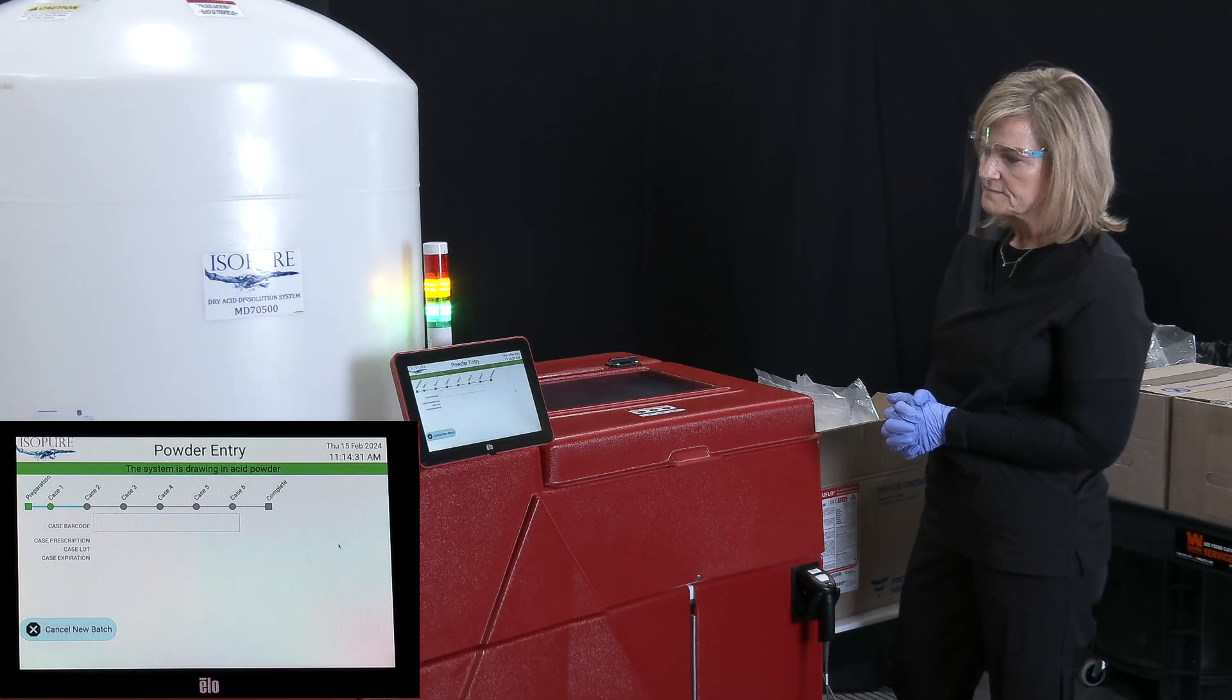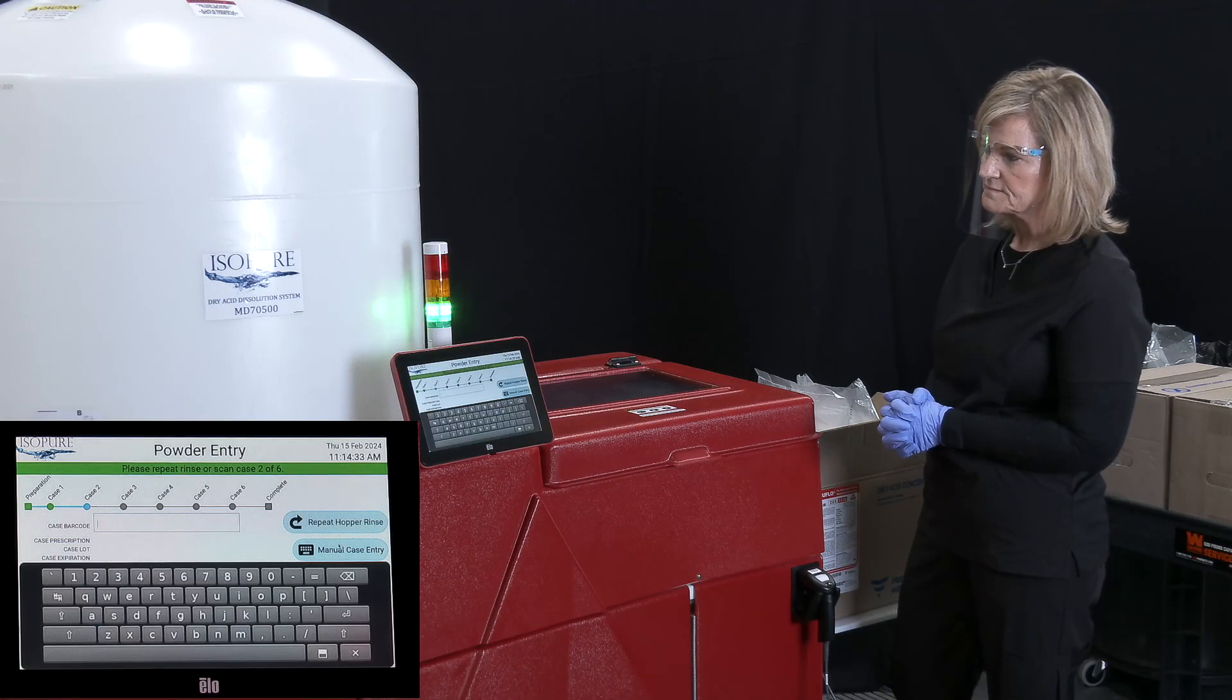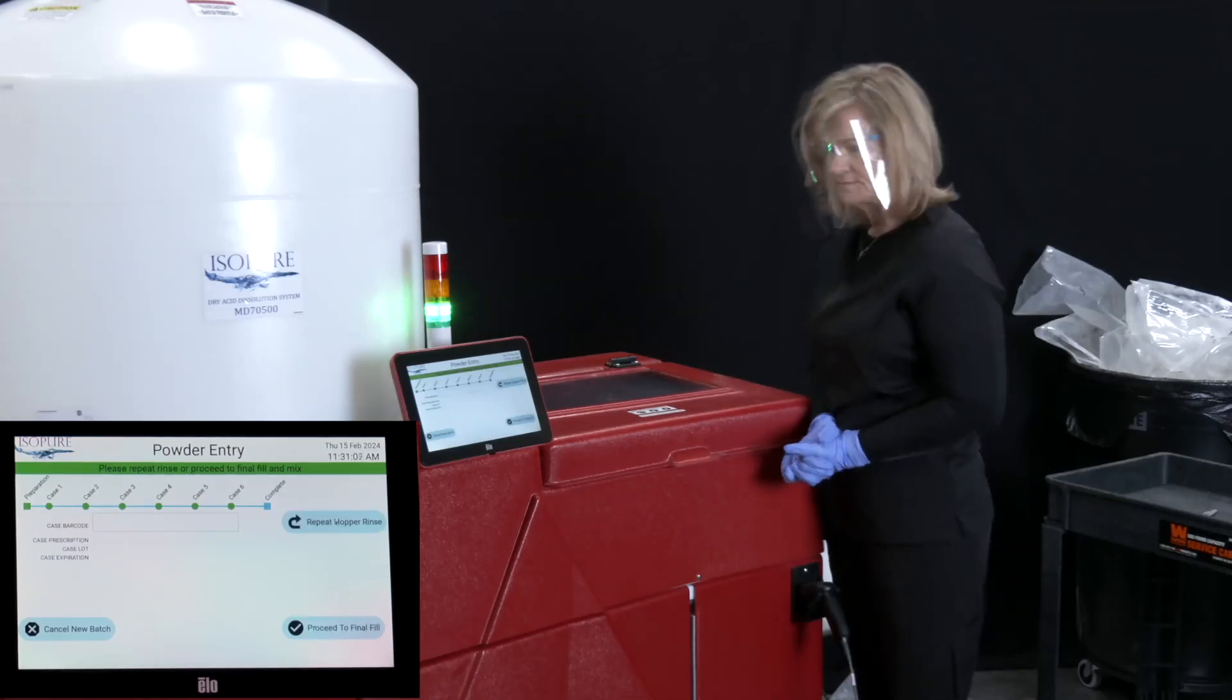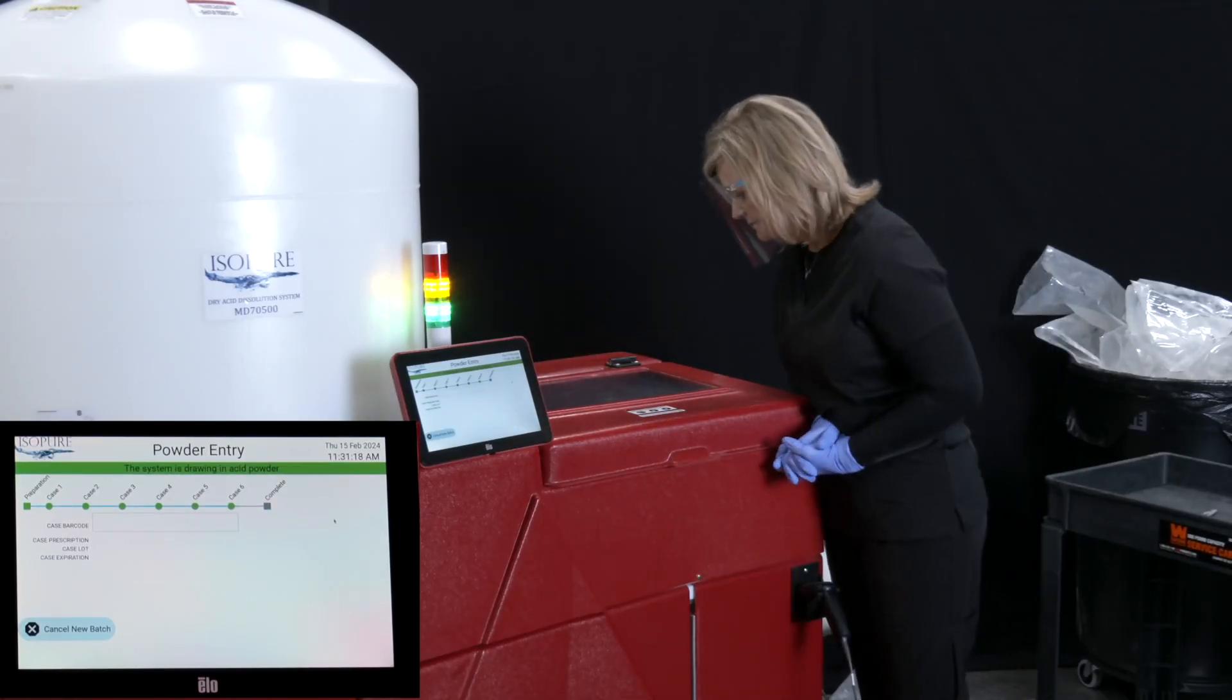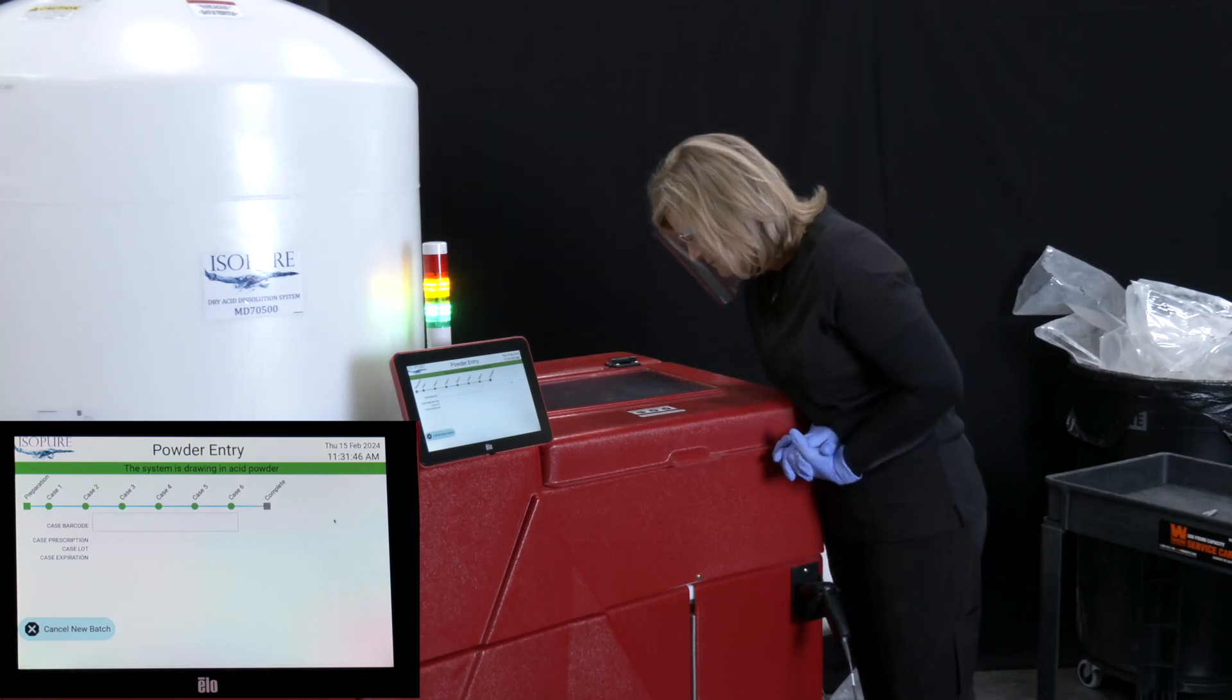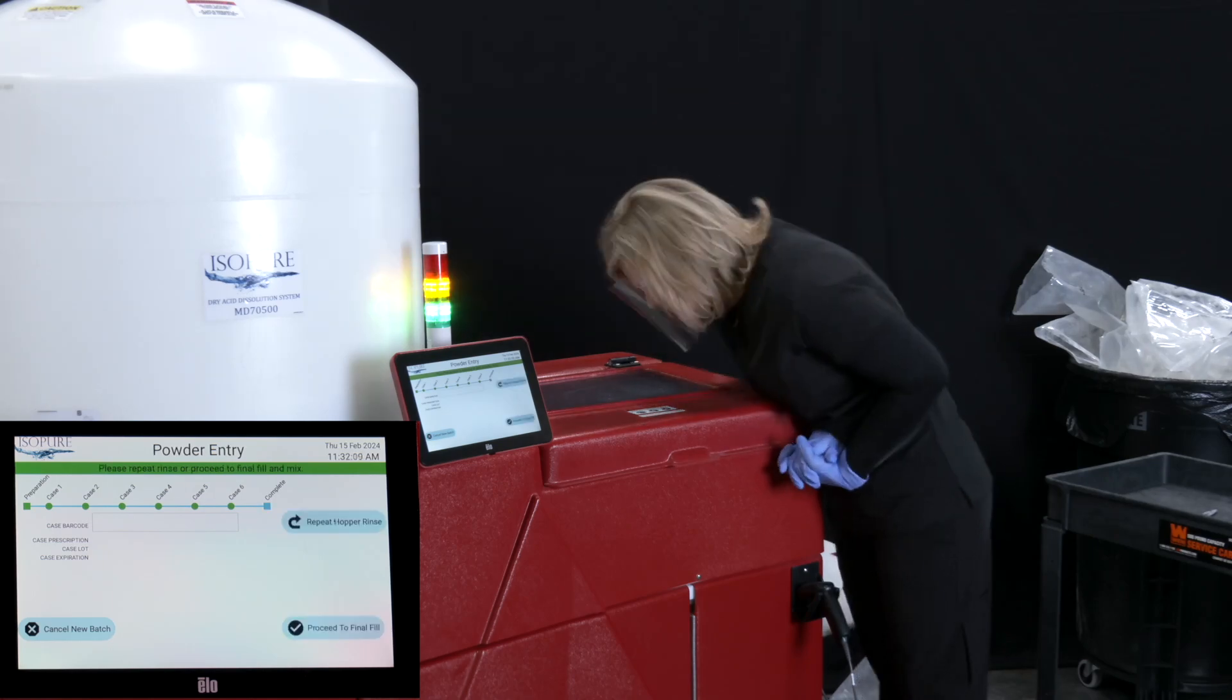After each hopper rinse, the Acumix will prompt the operator to either repeat the rinse or confirm the hopper is empty. At this point, the operator should look inside the hopper to ensure that no powder has been left. Residual acid left in the hopper may lead to a failed batch.